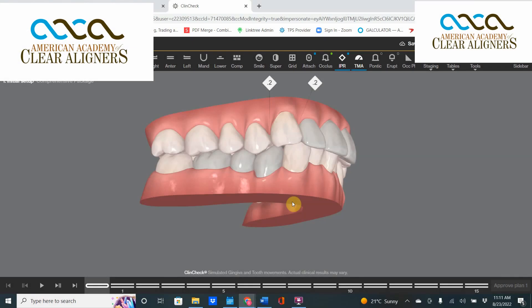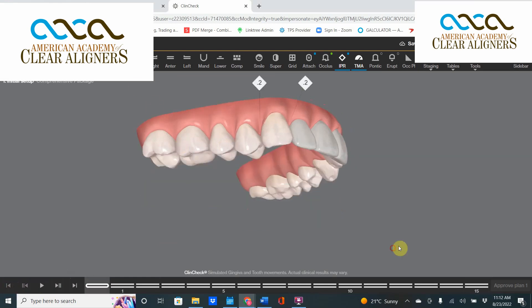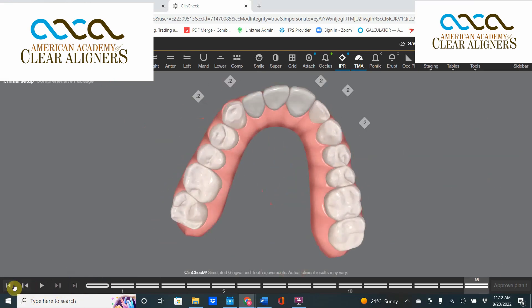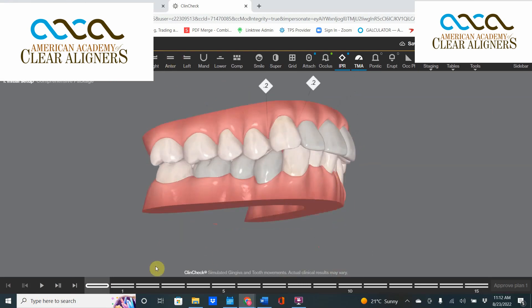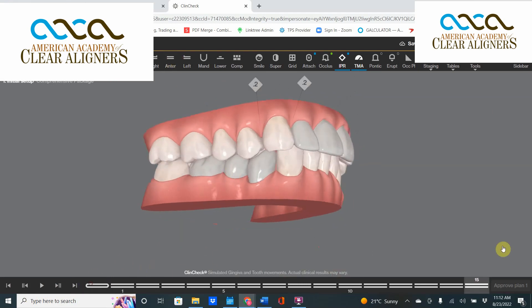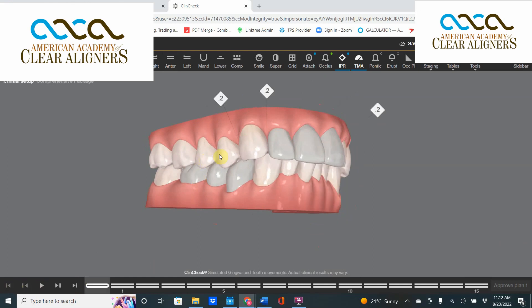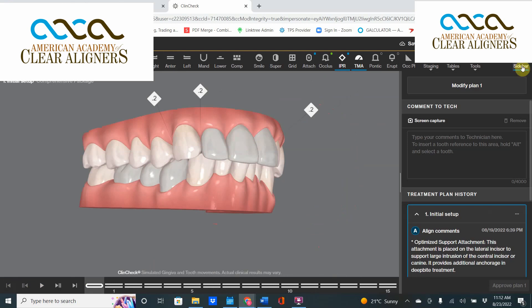Good morning and welcome to another edition of ClinCheck Theater Thursday. I am your host Dr. David Gallard. Last week we were looking at a situation where we noticed herky-jerky movements on these premolars. The premolars don't really accomplish anything and this movement doesn't really help anyone. The only reason the computer automatically did these movements was to try and align the first and second premolars a little bit better, but that's not part of my chief complaint. What I don't like is my end-stage occlusion on the first premolars — I like it better before treatment — and I don't like this contractual movement on that second premolar. I think it's just going to lead to an interference, which will lead to a posterior bite.